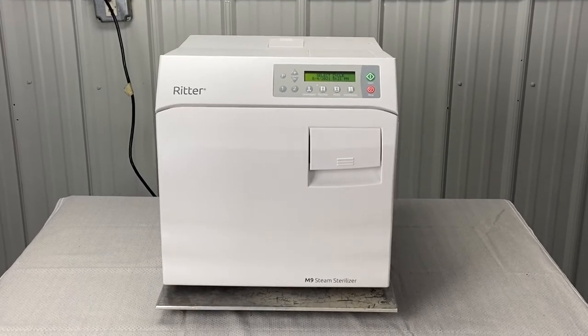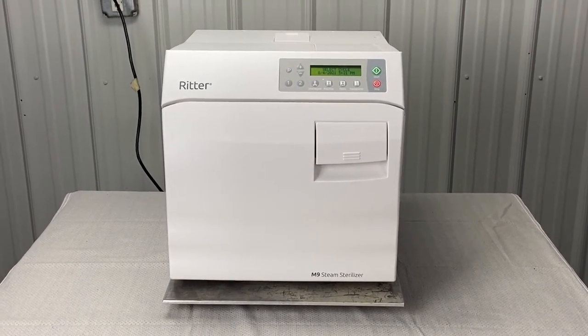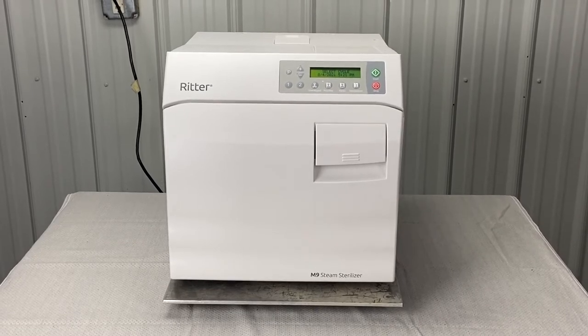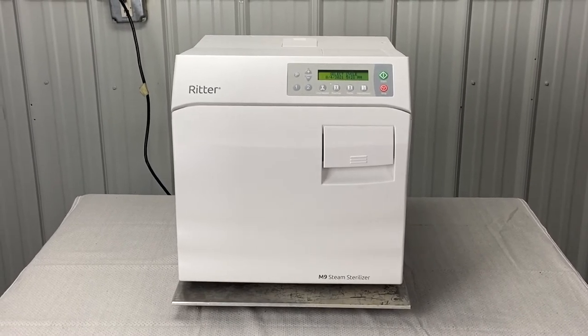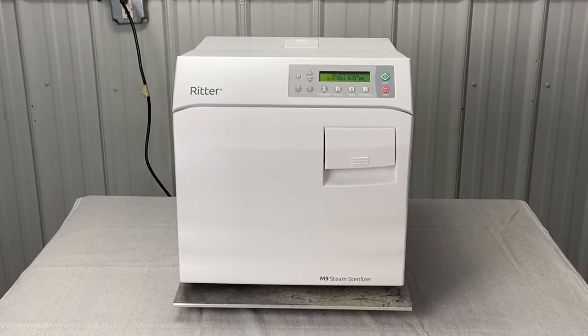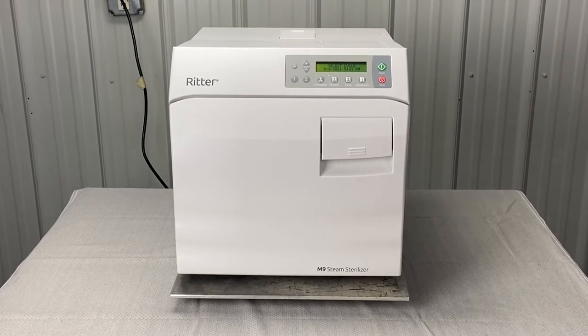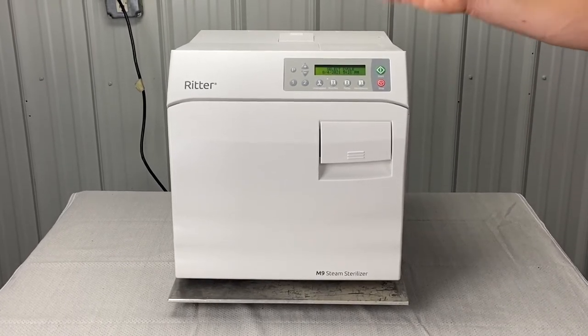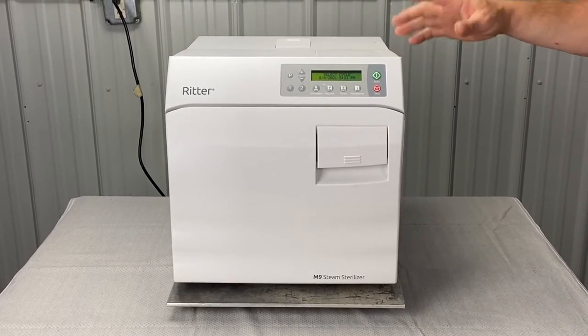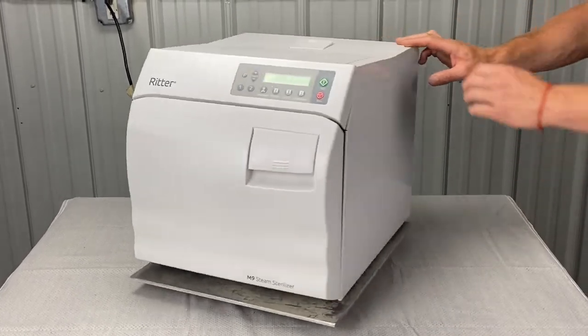We are doing Midmark troubleshooting videos — Midmark M11 / Midmark M9 new style troubleshooting videos. In a lot of our videos, or even in some of the maintenance to replace parts, you will have to take off the top cover. I'm going to show you how to do that. You basically just need a Phillips screwdriver and 10 minutes or less.